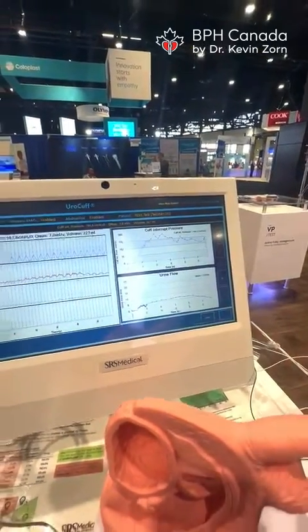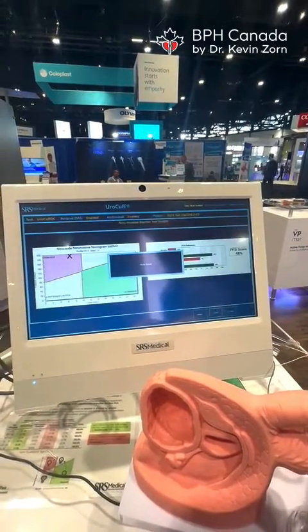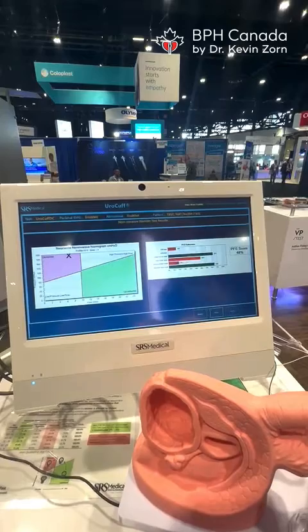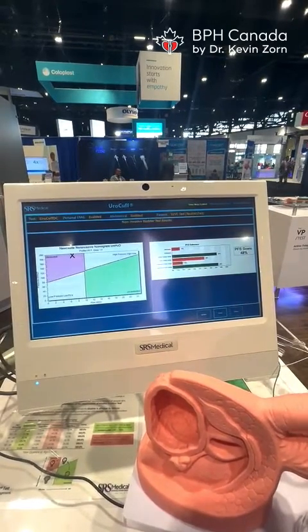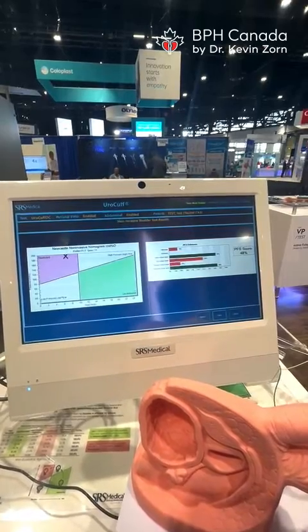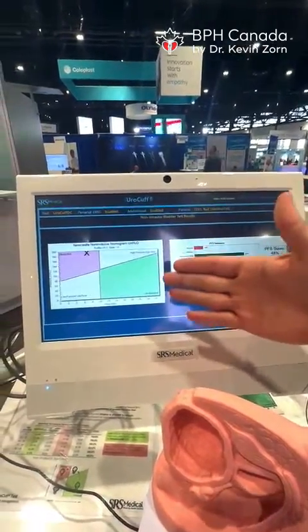So this is functional. We call it compensatory, in that a patient's bladder initially, like going to the gym, will get thicker. It'll work harder to generate a flow, and eventually that bladder can tire out and the gentleman goes into retention. So the report that we'll generate for the patient will include 4 boxes.